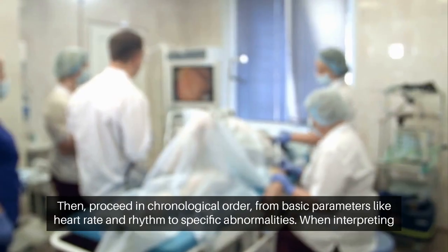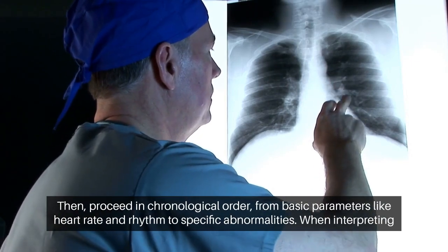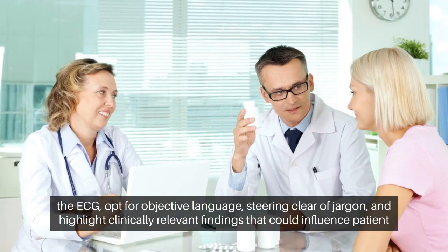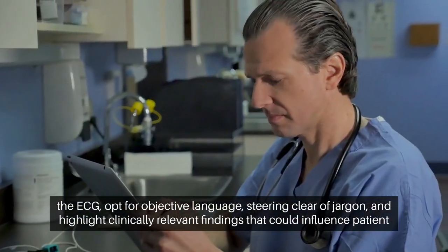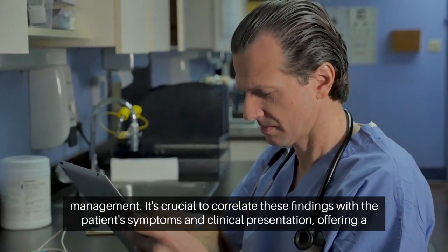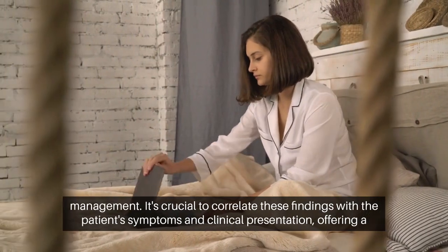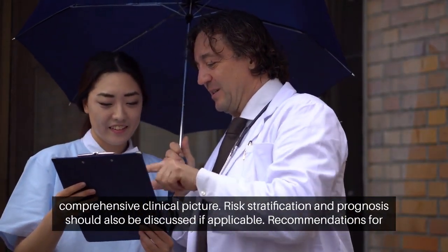Then proceed in chronological order, from basic parameters like heart rate and rhythm to specific abnormalities. When interpreting the ECG, opt for objective language, steering clear of jargon, and highlight clinically relevant findings that could influence patient management. It's crucial to correlate these findings with the patient's symptoms and clinical presentation, offering a comprehensive clinical picture.